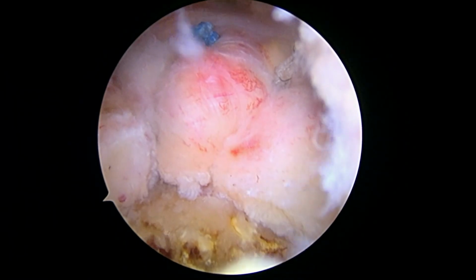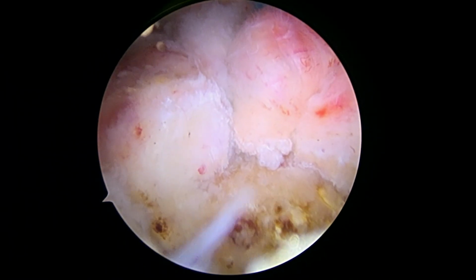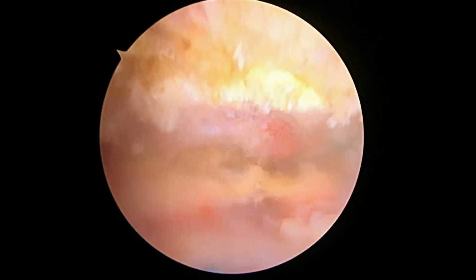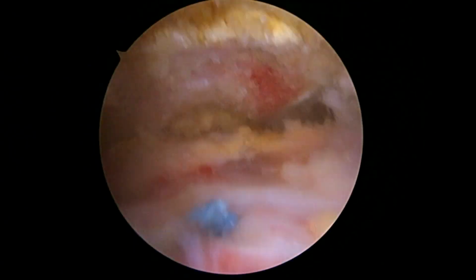And so when I turn down the pressure on the pump, or even turn it off, you'll see some of the bone marrow elements start to come out of those little holes. You can see it already there. Okay, and that helps in the healing because that has a bunch of growth factors and proteins and things that help things heal. So we're going to finish up here.